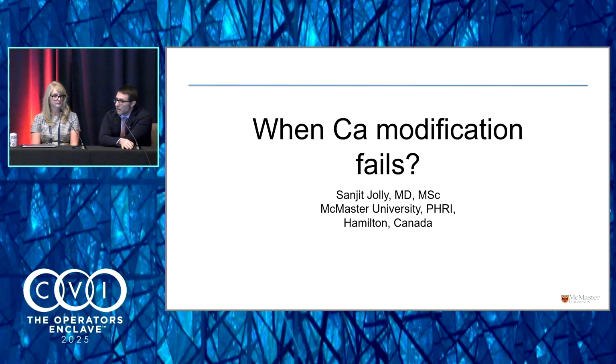So I think we use it in both situations, and not only in this situation, uncrossable lesion, like you showed before, where just the rotablator crosses, and which is the next step? This is the question. After the rotablator crosses, the lesion is still there, which is the next step? So I think this is a lot of question about the evil calcified lesion which needs to be answered in the future.